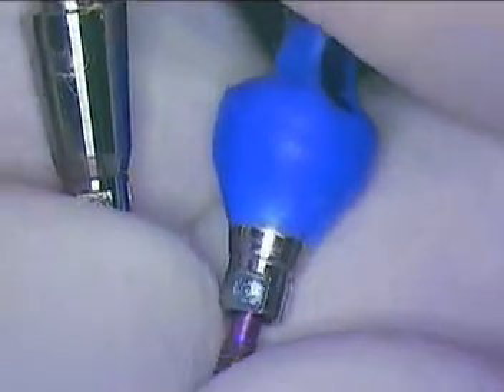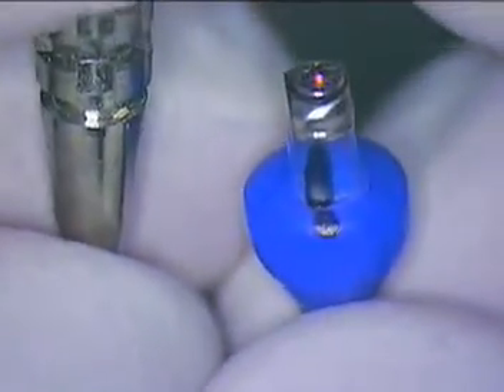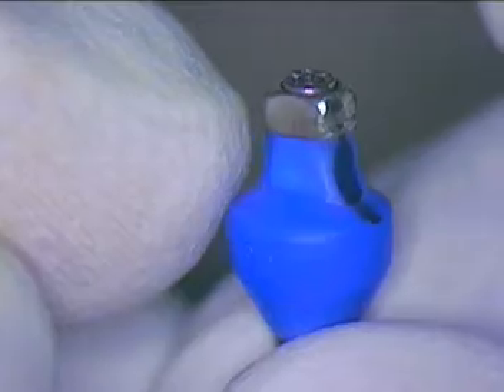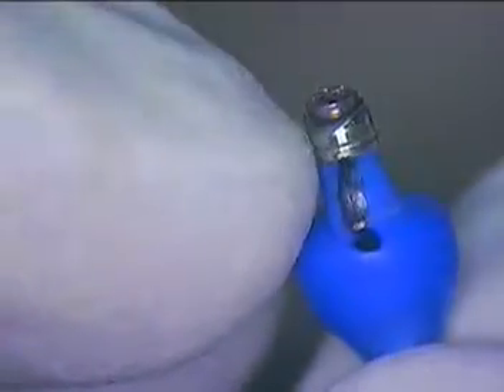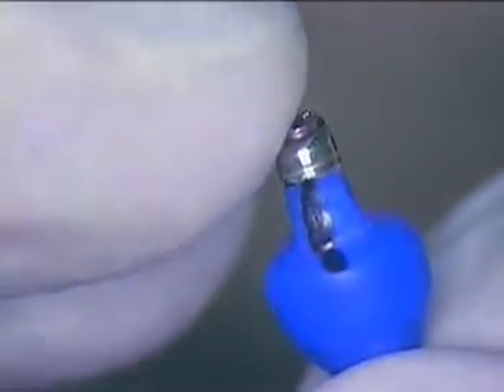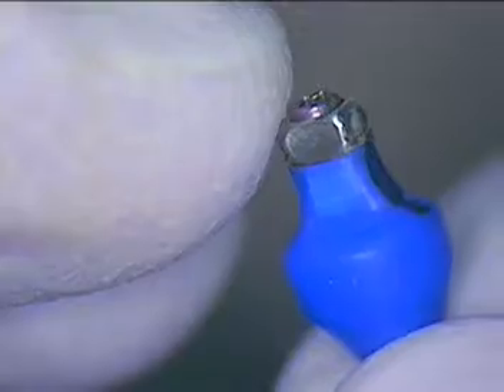Right now we're just finishing up placing the wax, waiting for my dental assistant to finish that up. Let me talk about how we came up with this idea. Basically, we wanted to have a transfer coping that did not in any way elicit any sharp radii or sharp line angles. If you look at this very closely, you'll see that everything is significantly rounded.